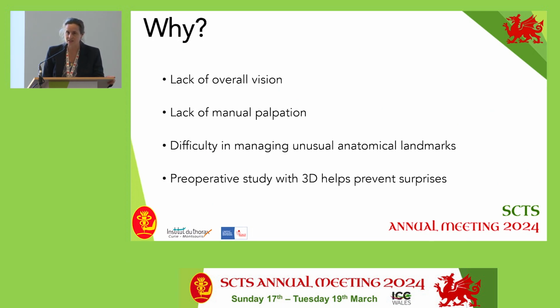So why do we need a 3D reconstruction? I'm quite sure that you are trying to do your best to offer a minimally invasive option for your patients. So you will probably agree with me that there is a lack of overall vision, either by RATS or by VATS, that you can't put your hands inside the thorax, that sometimes it's difficult where there is some unusual anatomical landmark, like, for example, the intersegmental plane, if you have no ICG injections. So the preoperative study will probably help us to prevent some surprises during the operation.